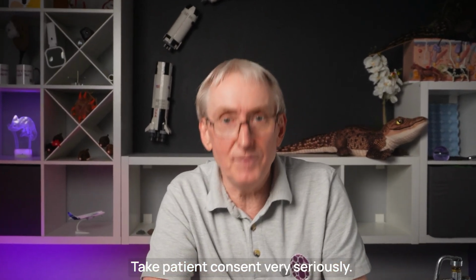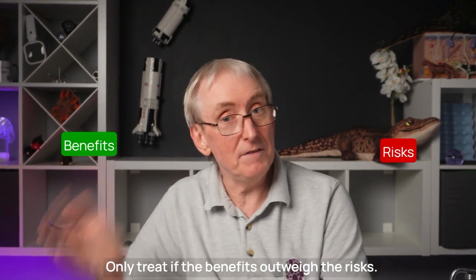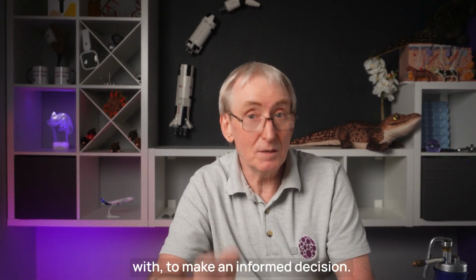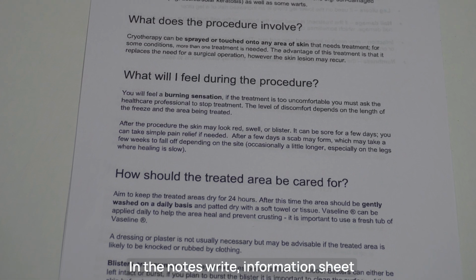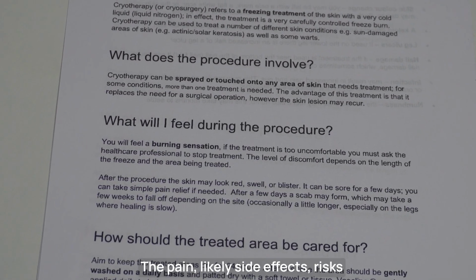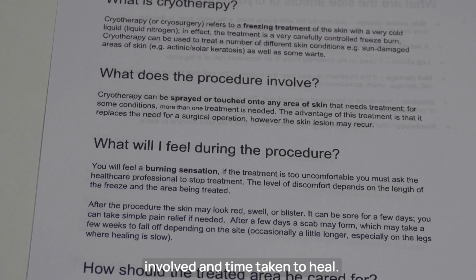Take patient consent very seriously. Only treat if the benefits outweigh the risks. And that's for your patient to decide, not you. But this only works if you have given them the right information to begin with to make an informed decision. In the notes, write: information sheet provided and discussed before cryo. The pain, likely side effects, risks involved and time taken to heal.